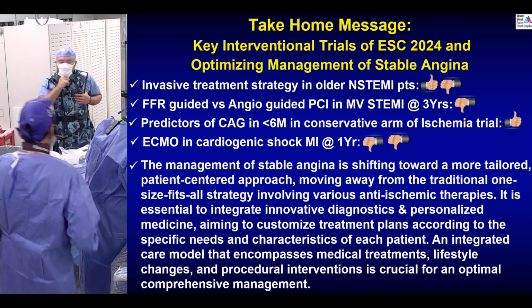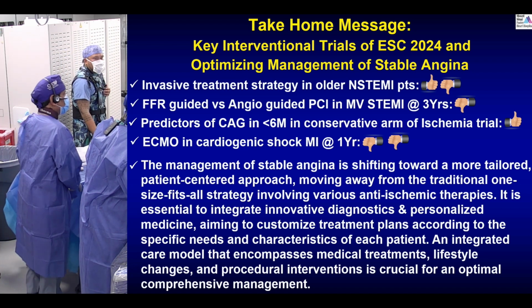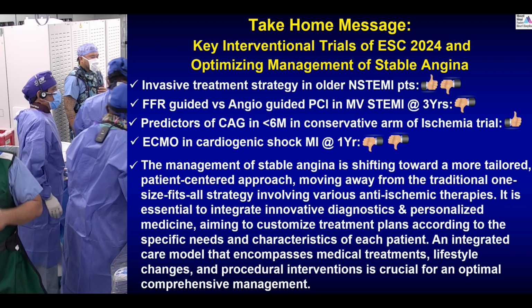With that note, I think Anu is about done with the things. Right? Give me that. If it goes, what do you have now? No, we were done. Go to the everything.